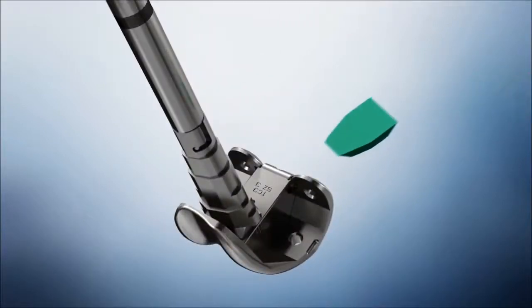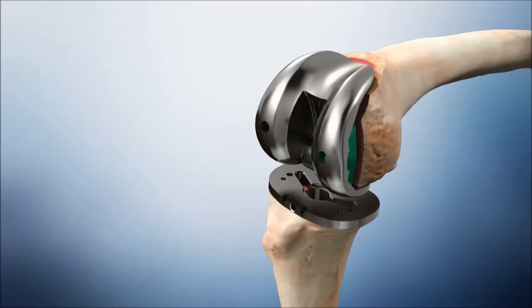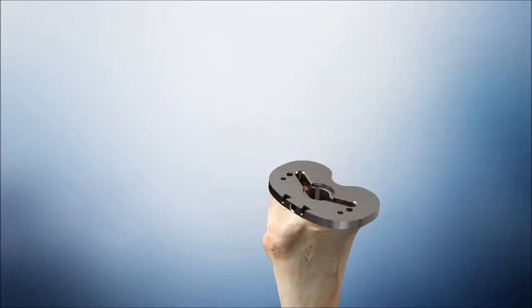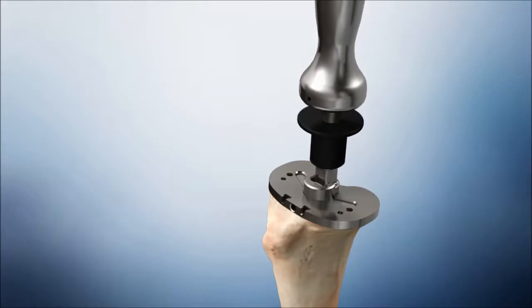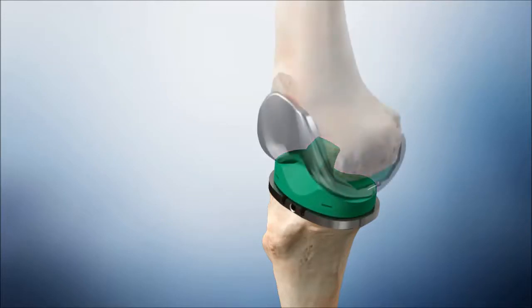Assemble the appropriate trial augments. Seat the femoral trial assembly on the femur. Utilize the femoral impactor to fully seat the femoral trial component. Impact the keel punch. Utilize the cemented keel punch if a cement mantle is desired, or the press-fit keel punch if line-to-line contact is desired. Leave the keel punch in place for trial reduction and introduce the insert trial.